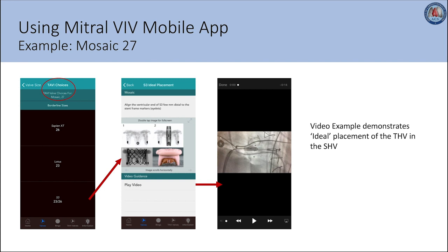Continuing with the same example for Mosaic 27, suitable TAVI choices are presented. If you select Sapien 3, size 23 or 26, information regarding optimal deployment and placement are provided. The play video link directs you to a recording that demonstrates ideal placement and deployment of the transcatheter heart valve within the surgical heart valve.